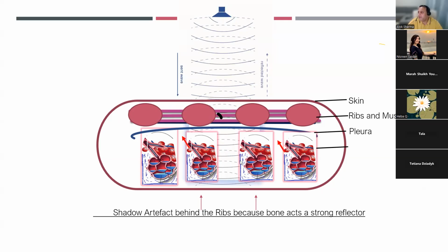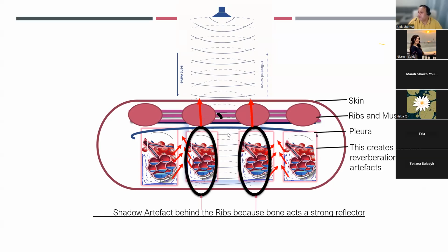Now, naturally, you'll have a large amount of reflection back from the bones, with virtually nothing coming in this region, which is the tissue behind the ribs. But a lot of sound waves are coming and interacting with tissue in the soft tissue areas. So this causes dropout. And when you have dropout, basically what you get is a bright rib margin and a bright pleural margin. And this is what you call the batwing appearance.